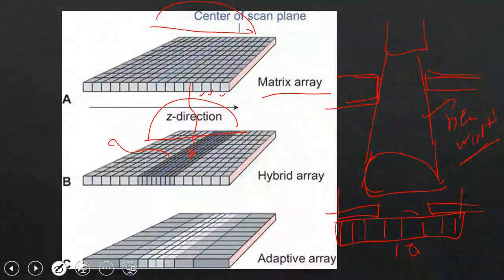The idea here for me is that today, the closer you are to the center of your X-ray beam, the higher your detection efficiency and geometric efficiency will be. So, what makes him choose 2.5, which is far from the center of the detector, and work on it, even if he is going to do collimation and go up to 2.5? It's logical for him to work with the configuration that is easier or that gives higher detection efficiency.